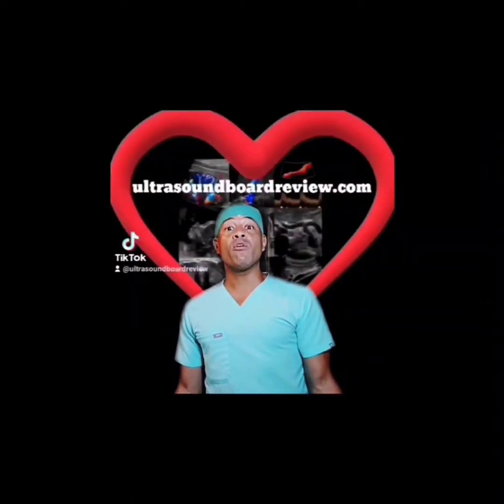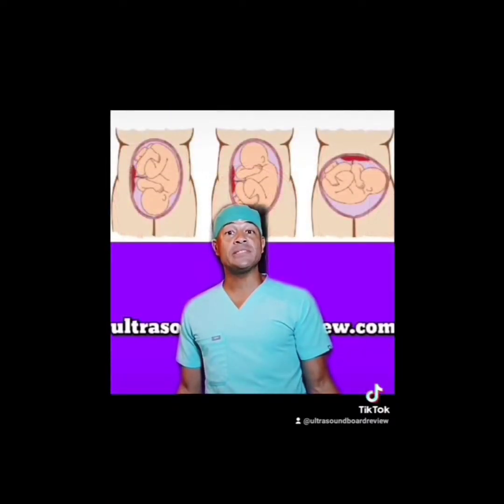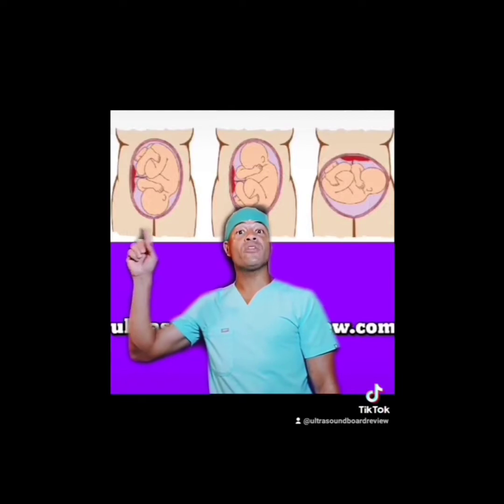Hey guys, Jimmy. Today we're going to go over how to determine fetal presentation and fetal situs. There are three basic types of fetal presentation. The first one is called cephalic or the vertex presentation.